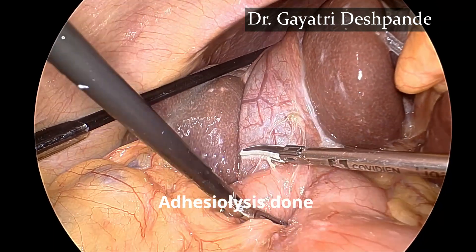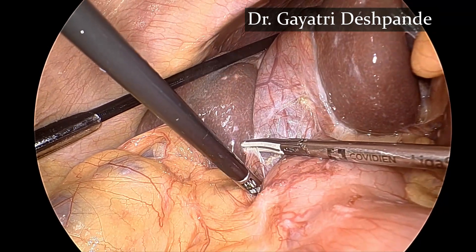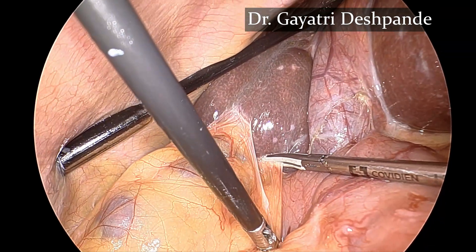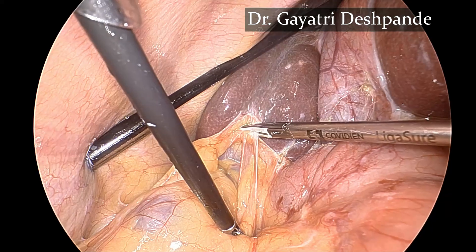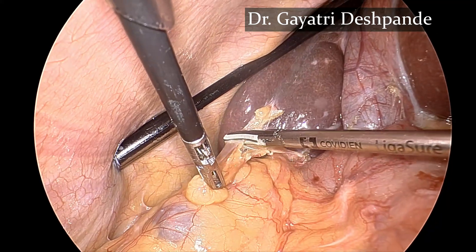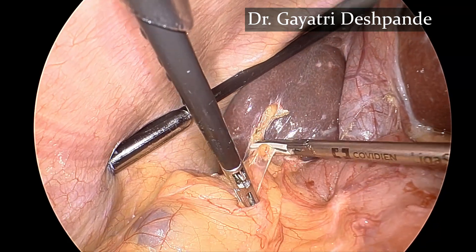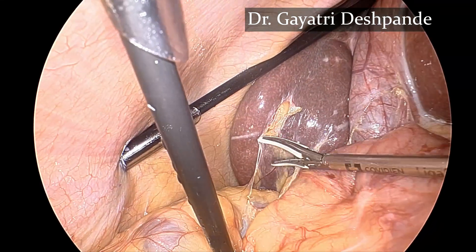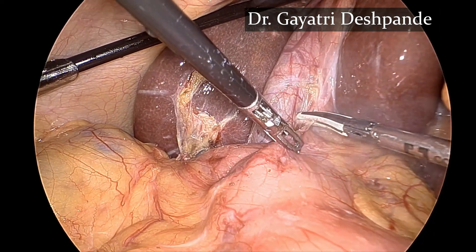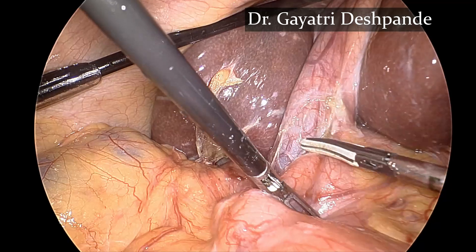This is a 52-year-old lady who presented with obstructive jaundice. On evaluation she was found to have multiple gallbladder stones with choledocholithiasis. On ERCP the calculi in the CBD were removed; however, there was a single stone of 1.7 centimeters in the common hepatic duct which was not retrieved, so stents were placed during ERCP. The patient is now taken up for laparoscopic CBD exploration.